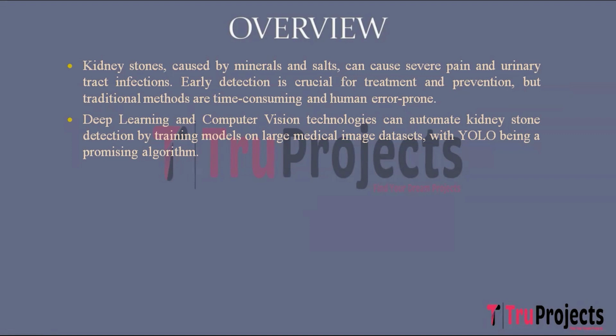And YOLO, that is, You Only Look Once, is a state of the art object detection algorithm which is particularly well suited for this task due to its speed and accuracy in detecting objects within images.